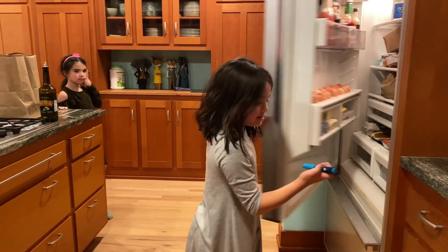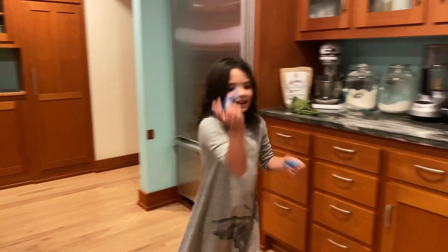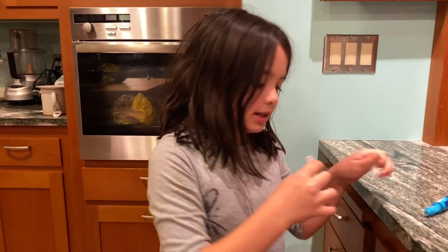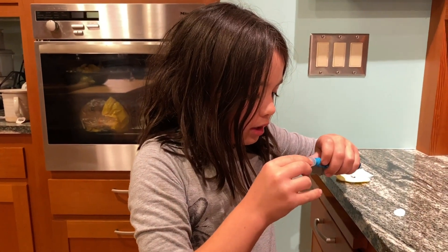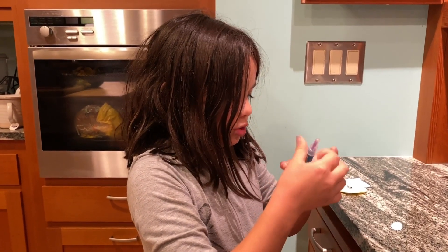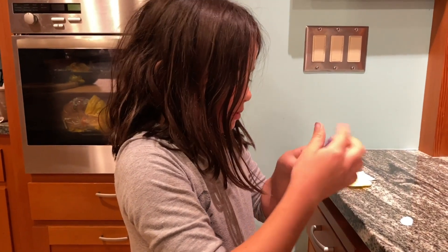And then now you open it over here. There's something that should go there. Now that's where this comes in — see the needle? You're going to put it in here. Now you're going to twist it so it gets in well.